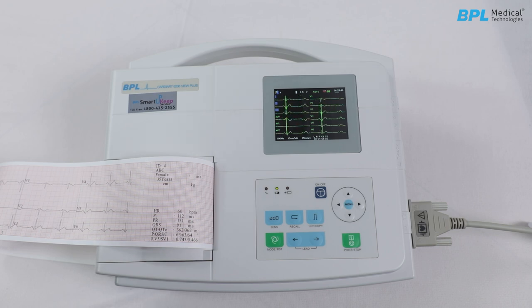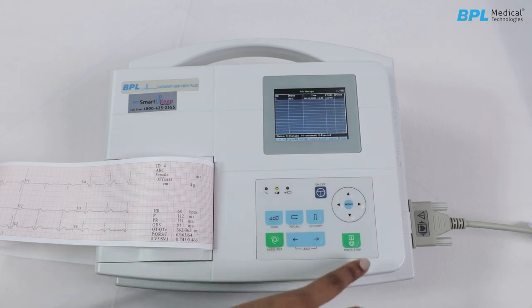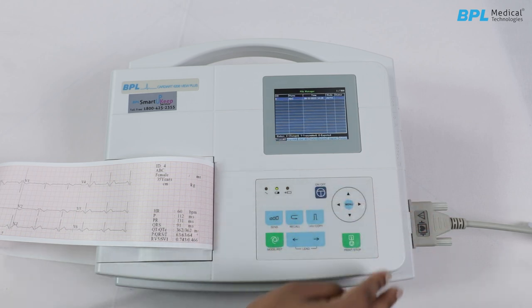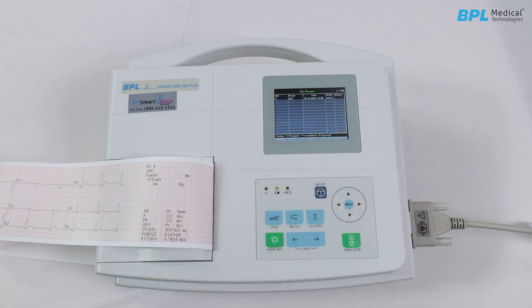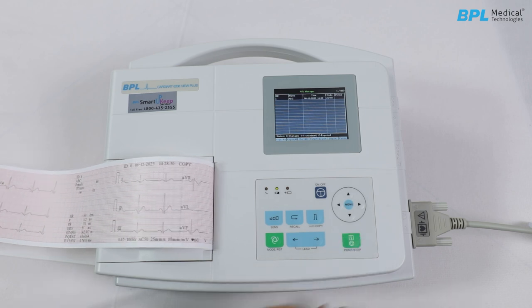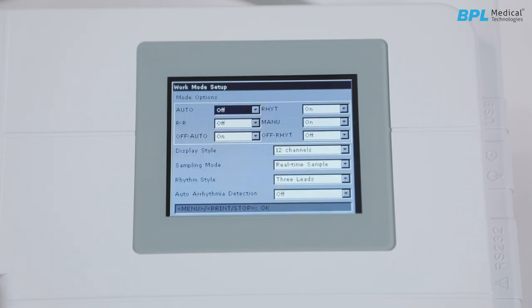For ECG recall, press the recall key to access the recall window for saved patient files. To transmit all files, use up/down to select transmit all, then press print or stop to initiate file transmission. In the system setup screen, first is the work mode. In the work mode setup window, press the navigation key to move the cursor among the different checkboxes and press the menu or print key to select the checkboxes.